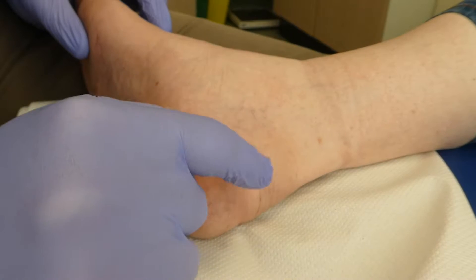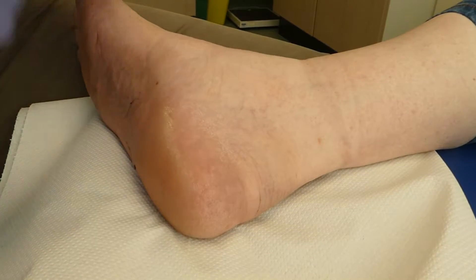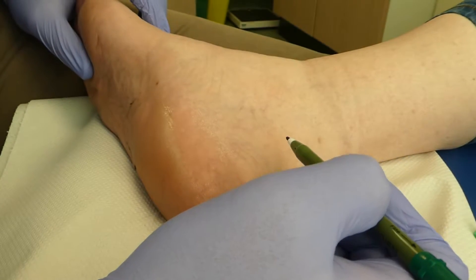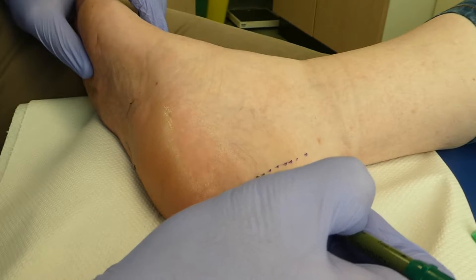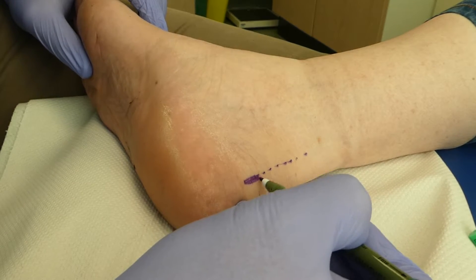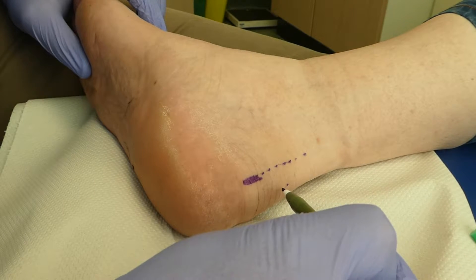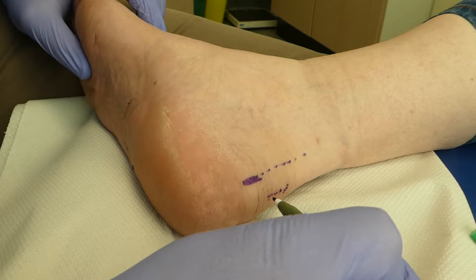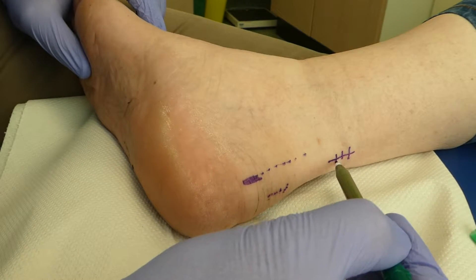This next case is Haglund's deformity with some pre-Achilles bursitis. Let's just mark some anatomy in. This lady's Achilles is coming down here. There's a little bit of insertional Achilles tendinopathy here — she's a little bit thick at the back, very slightly so. A little bit of insertional Achilles tendinopathy here. The non-insertional Achilles, which would normally be here, is fine.